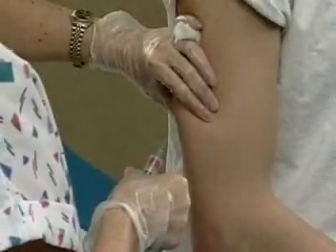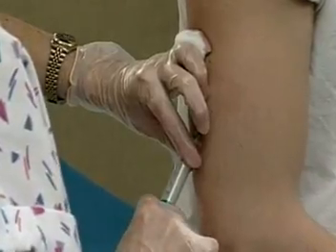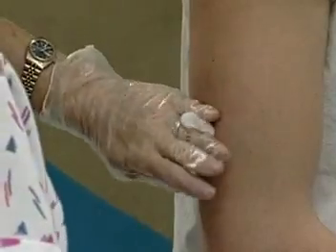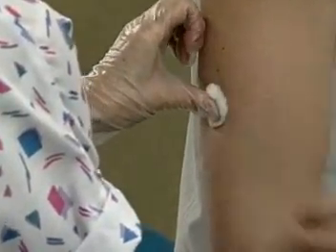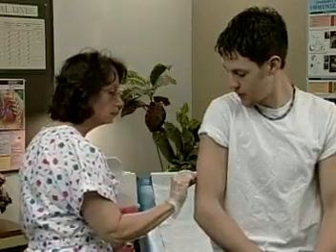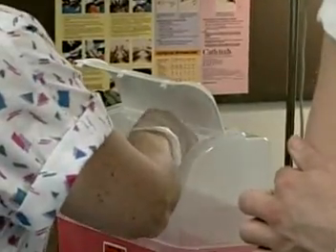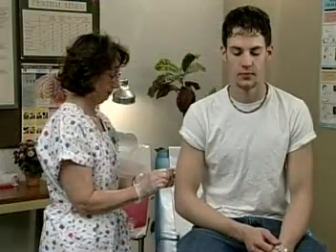Using a smooth darting motion, inject the needle into the base of the pinched tissue. Release the pinched tissue, stabilize, and inject the medication. Withdraw the needle quickly at the same angle as inserted. Cover the injection site with a cotton ball or alcohol pad. Gently massage the site to help distribute the medication unless contraindicated. Do not massage the site when injecting anticoagulants or insulin. Safely dispose of the needle and syringe according to agency policy.